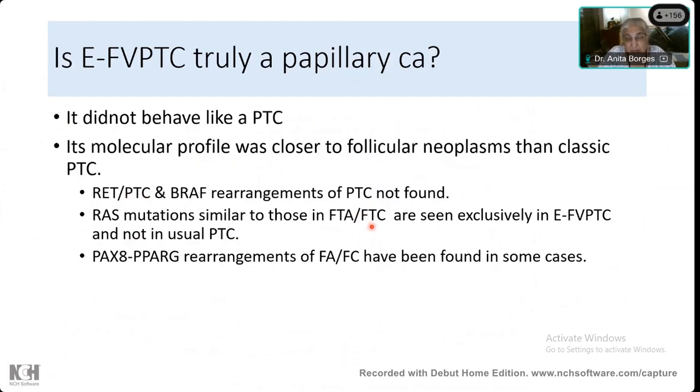So we're now beginning to understand that papillary thyroid carcinoma nuclei have to be used very judiciously when we want to call something a papillary thyroid carcinoma. It is perfectly okay to use it for diffuse infiltrative lesions, albeit that they are follicular, but we should try not to use it, or try to understand what it means, in an encapsulated follicular patterned lesion.